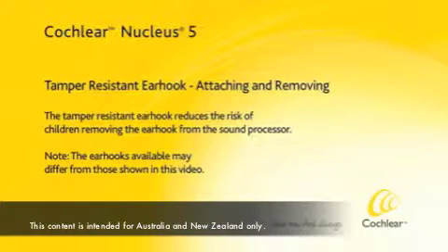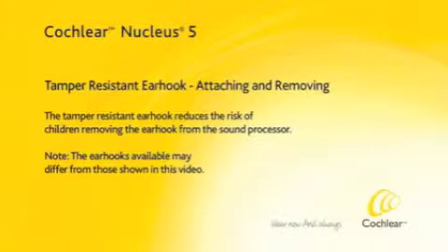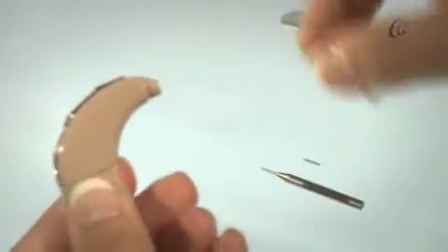The tamper-resistant earhook reduces the risk of children removing the earhook from the sound processor. Remove the standard earhook from the sound processor.